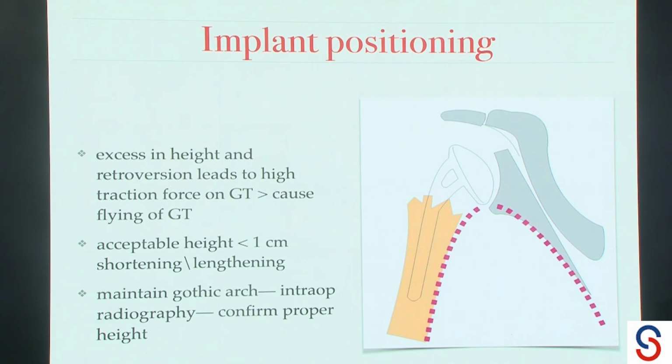When you go in, you use a forearm axis, which is distinct from the epicondylar axis. Okay. And so your measurement, say you measure 33 degrees using the forearm axis. Even for the same patient, both these axes give you a different reading. Yes. So be very careful on that. That's very important because your effort should be to try and get your native version, which is again very dicey in trauma because there is no landmark there.